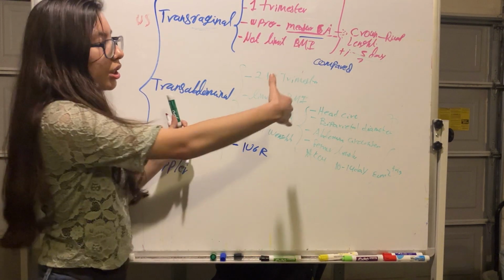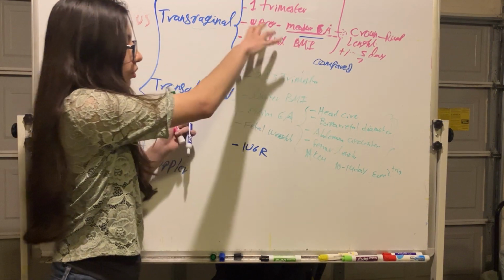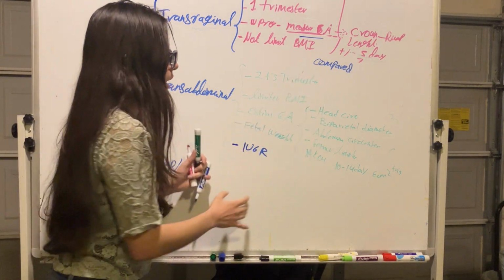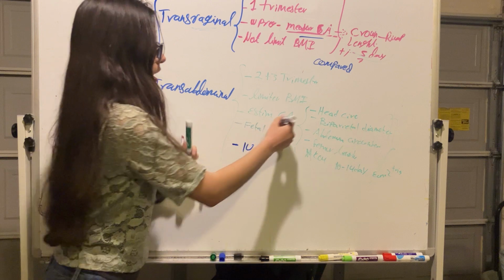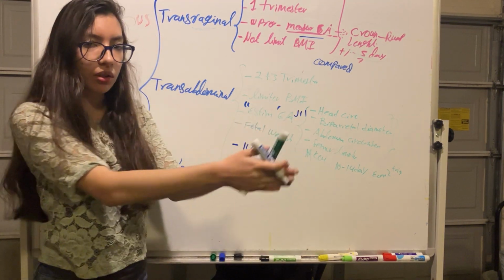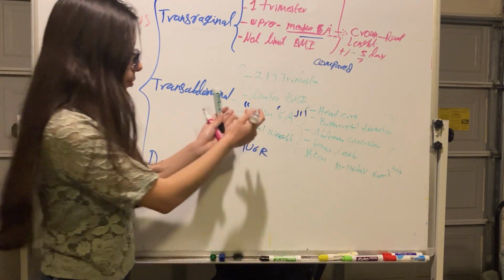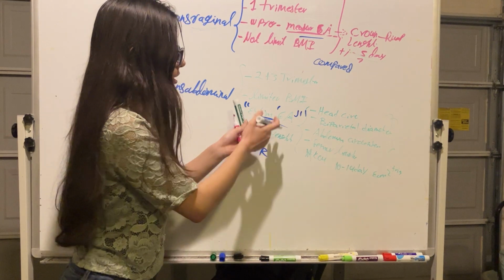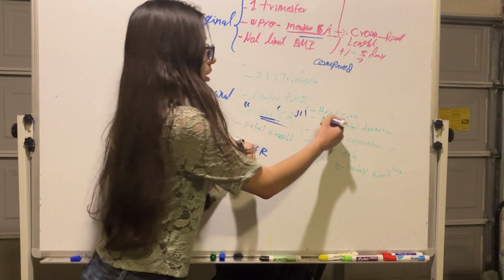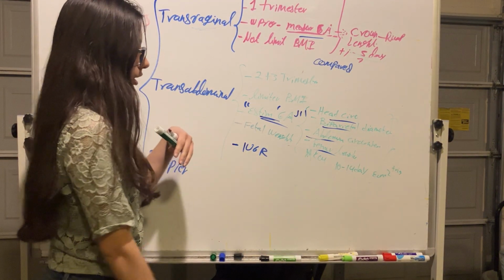So the gestational age based on the transvaginal ultrasound, always in the follow-up visit, is going to be compared with a new gestational age estimation done during each transabdominal ultrasound, during each visit. This estimation is going to be made with head circumference, biparietal diameter, abdominal circumference, and femur length.